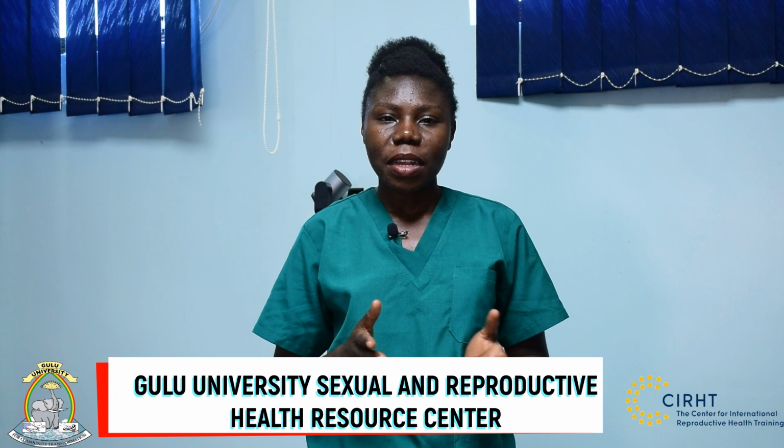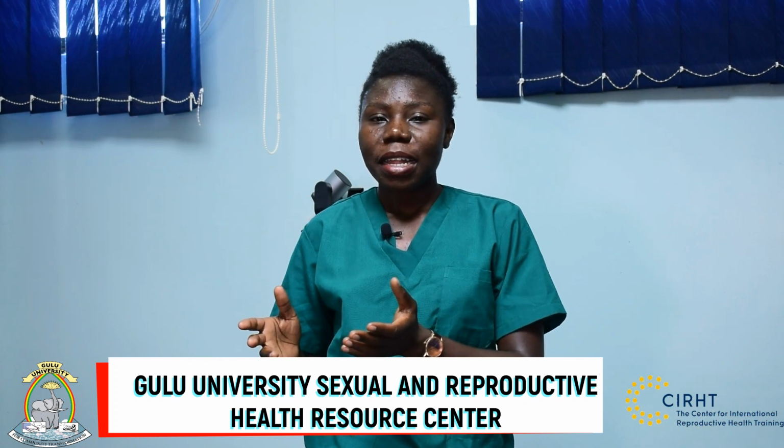Okay, so my name is Aikori Jacqueline, I'm a midwife, and I'm going to be taking you through the procedure of PPIUD insertion. There are three different types of insertions: a manual insertion, an instrumental insertion, and IUD insertion using the long special applicator for postpartum IUDs. But for the sake of this video, we are going to be concentrating on the instrumental PPIUD insertion. And now we have come to inserting the PPIUD.